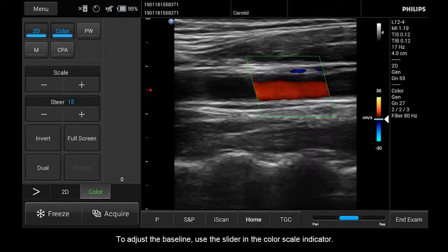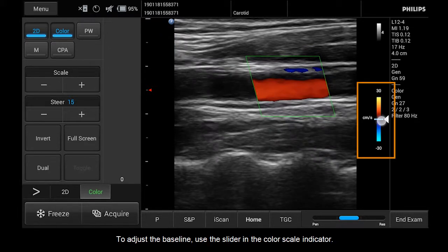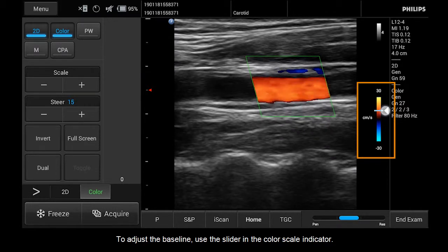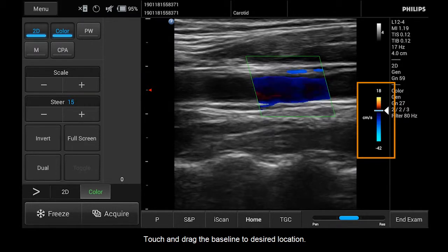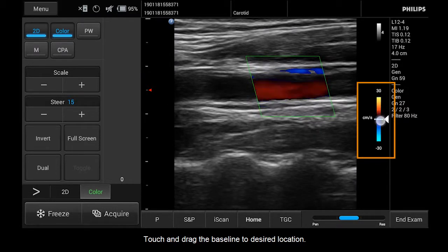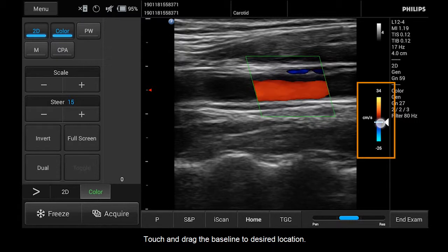To adjust the baseline, use the slider in the color scale indicator. Touch and drag the baseline to the desired location.